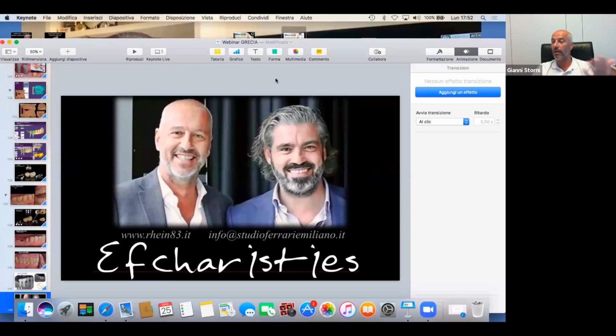So it is not only one retention abutment, it is one abutment for multiple uses. And what is very important is that it's really simple and economical, and it is available for all the implants.